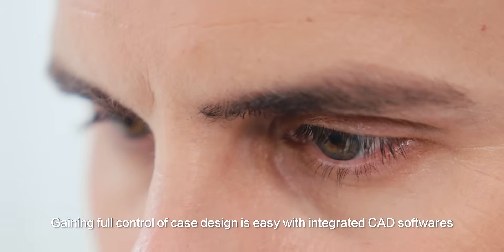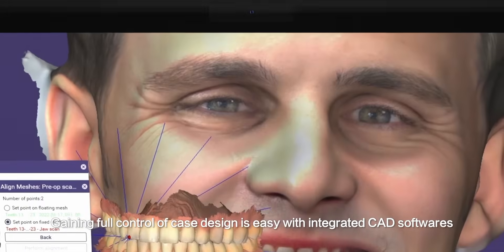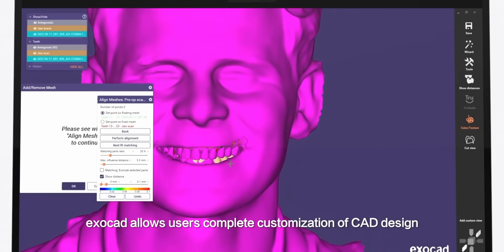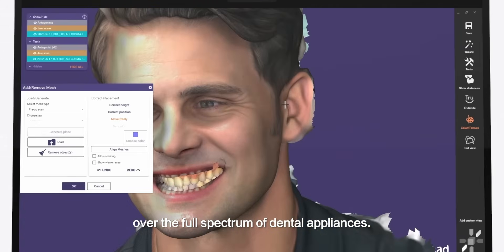Gaining full control of case design is easy with integrated CAD software. ExoCAD allows users complete customization of CAD design over the full spectrum of dental appliances.